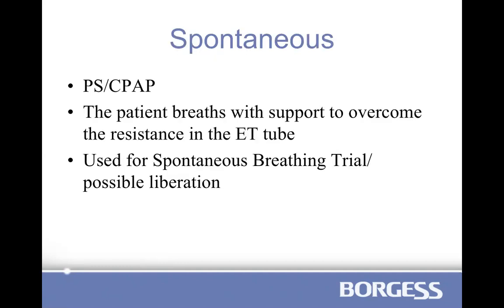Spontaneous is basically just that. The patient is given pressure support during the breath or continuous positive pressure, just like a CPAP. We use this mode mostly when you're trying to liberate from the ventilator, or if someone has been trached already and they're on a trach trial, basically to see how well they can do without any support at all. So this is the spontaneous mode.